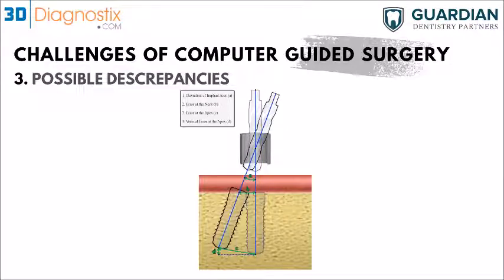So it's always better to try to place short implants as much as possible, depending on the site and the restoration. But this is also to understand that even with guided surgery, even if everything is done using the technology of the software and having the guide to help make sure everything is done according to plan, you should know that there is an anticipated discrepancy that might happen.